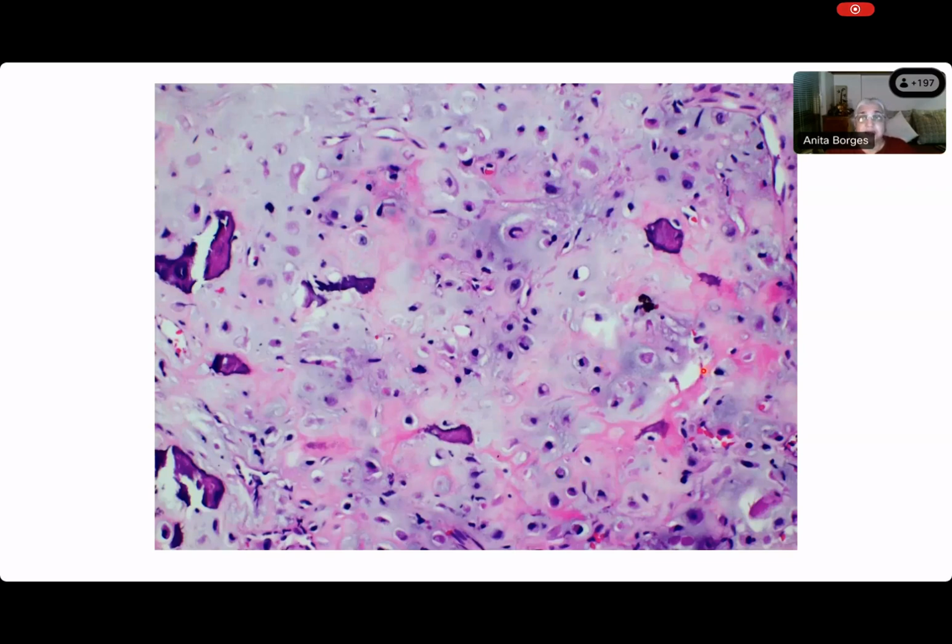So many of these nuclei, some, yes, are round. So they are varying. Some are oval. There is very definitely a density to these nuclei, but there are many nuclei that are crescentic. There's one, there's another one, there's another one, and others are irregular. Some of them are actually spindle in shape. So there is a variation in nuclear shapes, and some of them are crescentic.